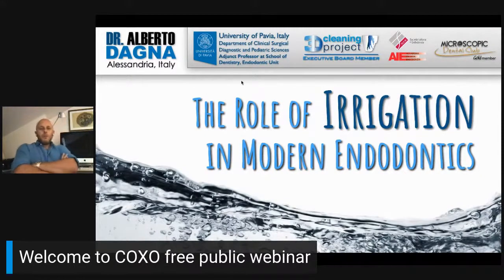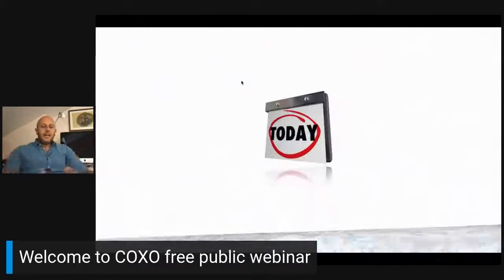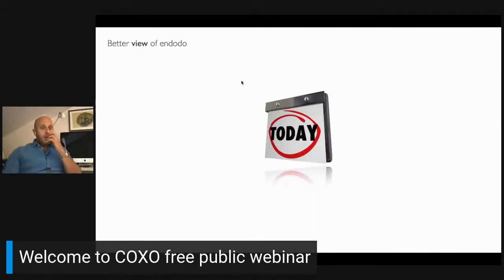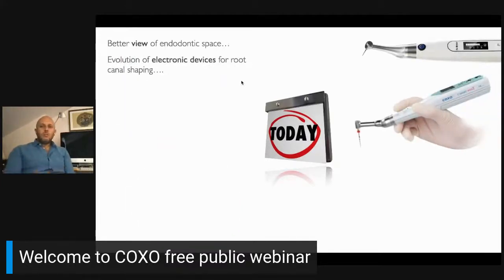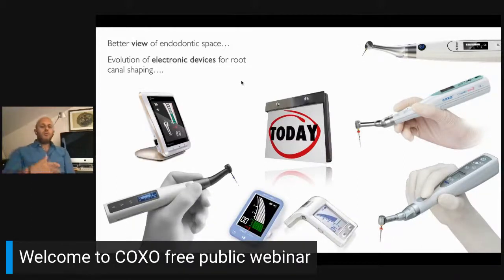Okay, my webinar today will speak about irrigation, because irrigation, I think, is one of the keys for the success in modern endodontics. Today, endodontics has evolved, and clinical endodontics is the result of more than 20, 30 years of evolution. Today, we have at our disposal the operative microscope that guarantees us the best view possible of the endodontic space, but we also have so many electronic devices to shape and treat the root canals, handpieces with control of speed and torque, and so many devices perfected in these years that simplify daily endodontics.